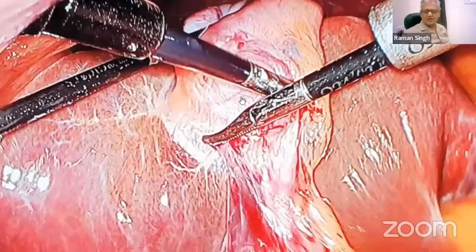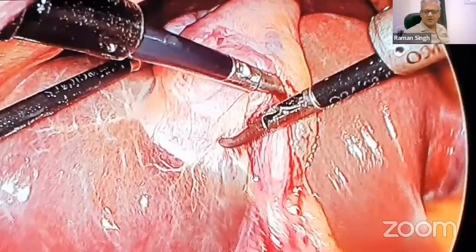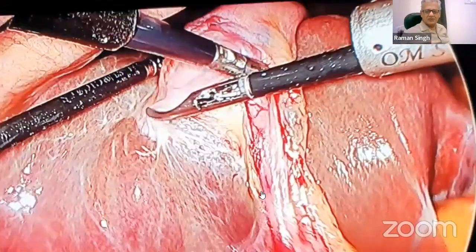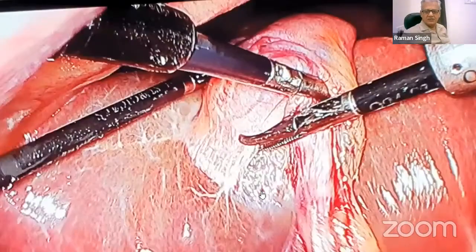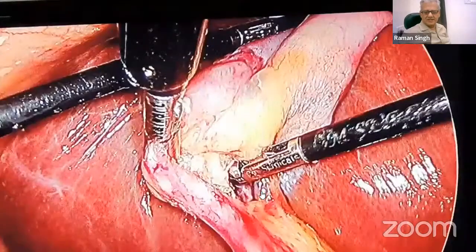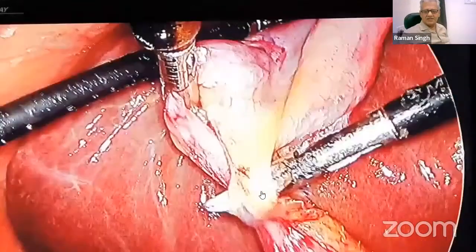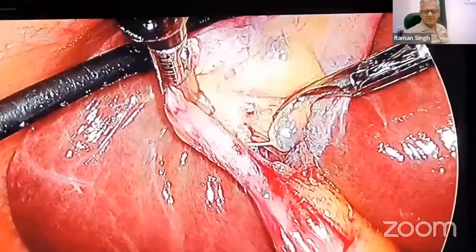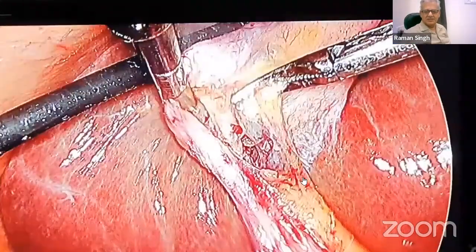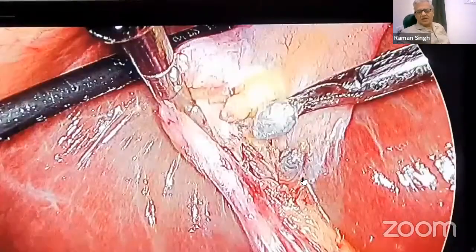It is pulling the gallbladder out far away from the common bile duct to prevent injury to the common bile duct. Because the dreaded complication in laparoscopic surgery is the injury of the CBD. And there is a surgical illusion that sometimes the surgeon feels that I am cutting the cystic duct, but actually this is not the cystic duct, it may be the CBD. And by accidentally cutting or injuring the CBD, after that the life of the surgeon and patient becomes hell.